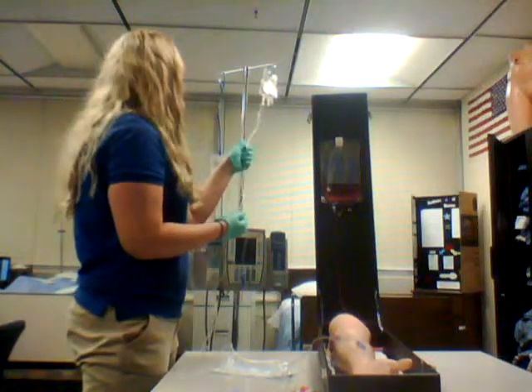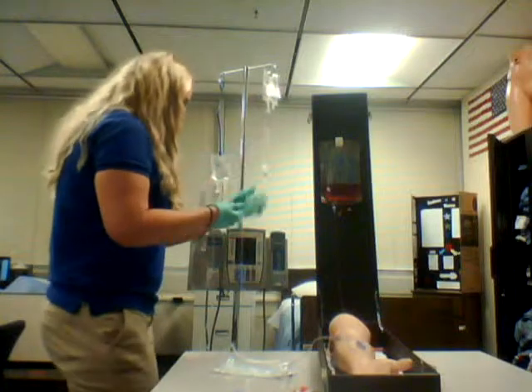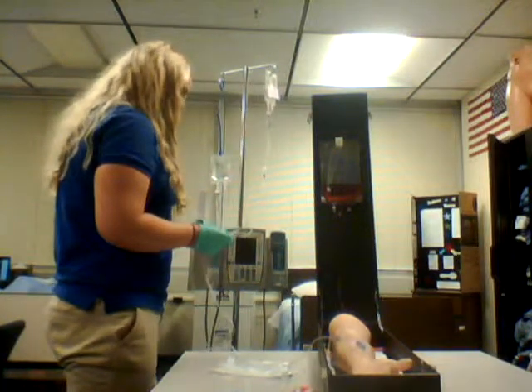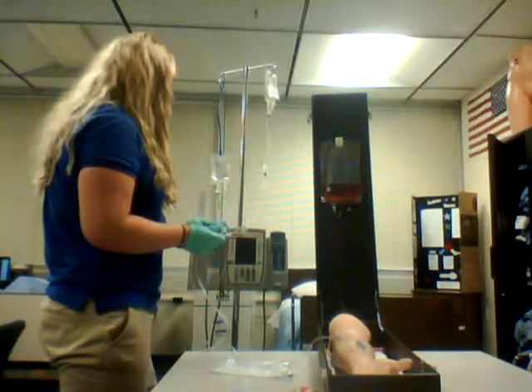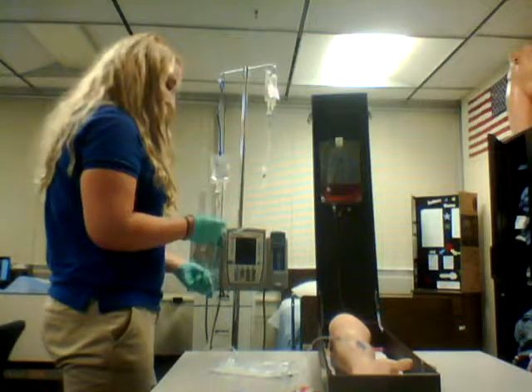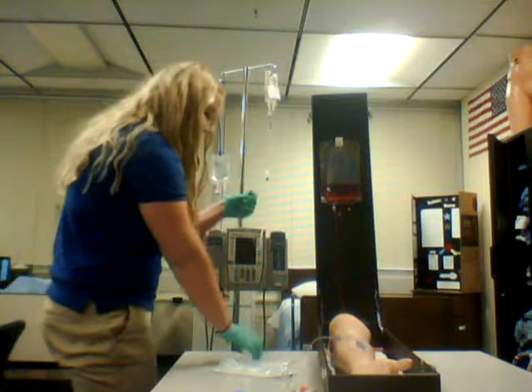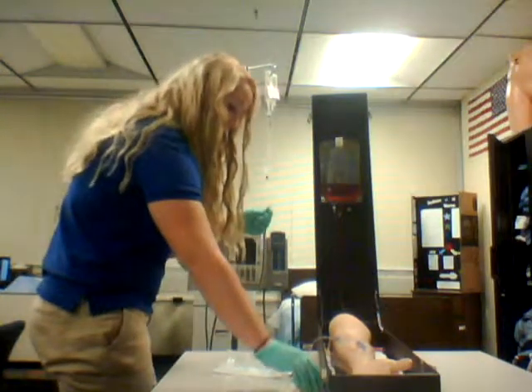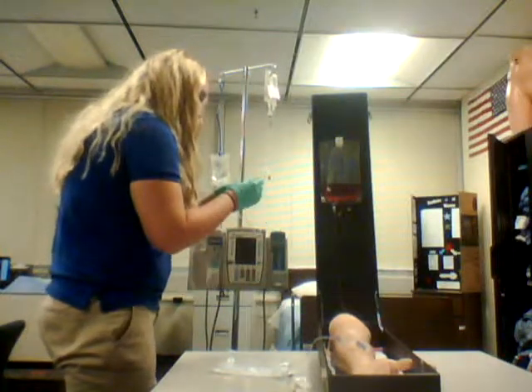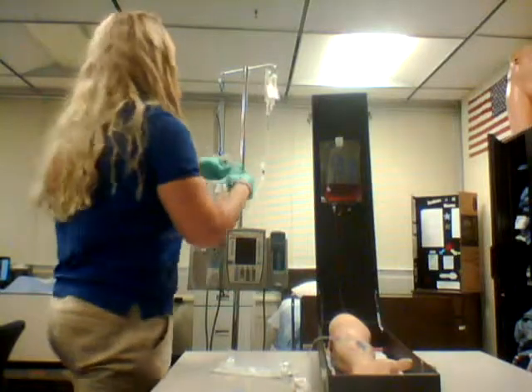What's going to happen is this is going to empty, and then this one will continue. So what I'm going to do at this point is close the gate, and then unclamp my primary tubing and reestablish the flow rate for the primary. I can start adjusting, and it's flowing beautifully. And then I'm going to remove the piggyback from the primary and put an alligator clamp on it to retain for a later administration.